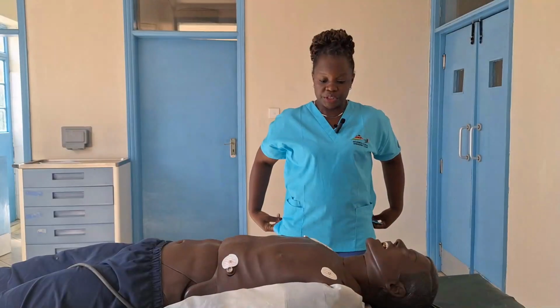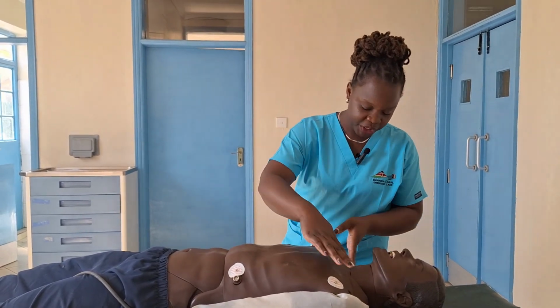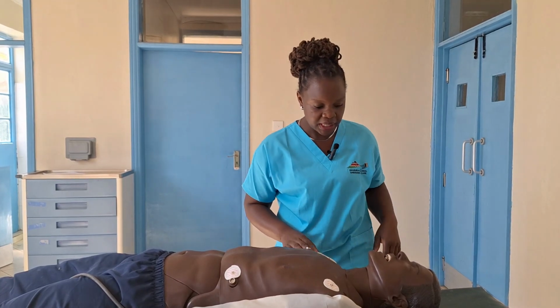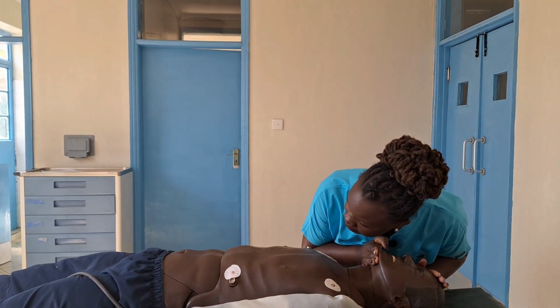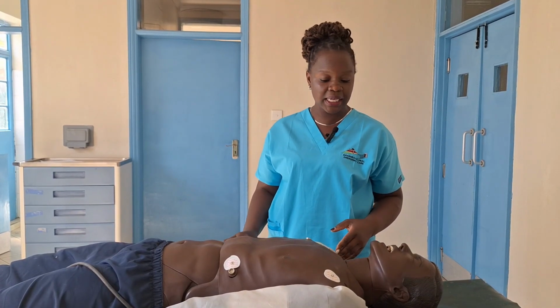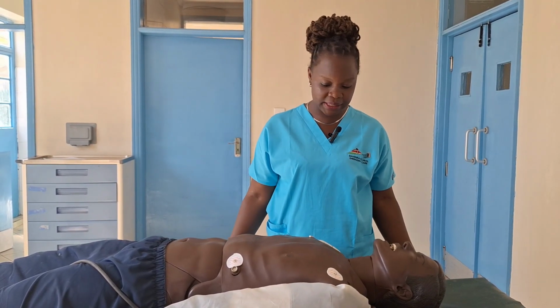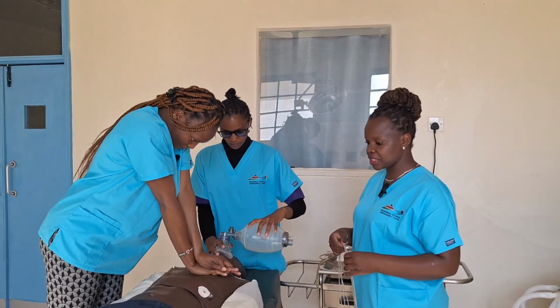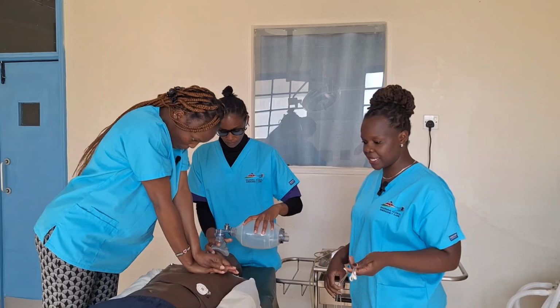That was a demonstration on how to manage a cardiac arrest patient. In the next step, I'm going to demonstrate to you step by step how we accomplish this. I've come in, found a patient who is unresponsive, called his name, there's no response. I checked for signs of life, there are none. I called for help for someone to bring in a defibrillator and a BVM mask, and at the same time I'm starting chest compressions. Jackie is doing chest compressions. Winnie is managing the airway.